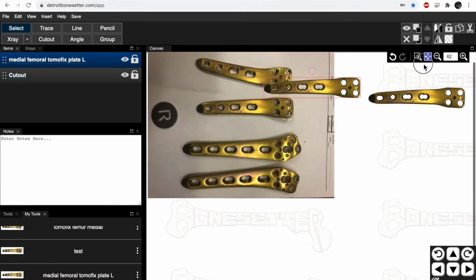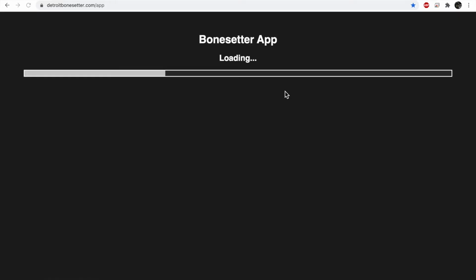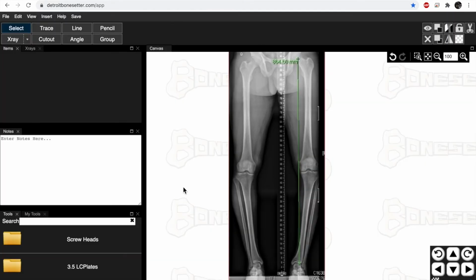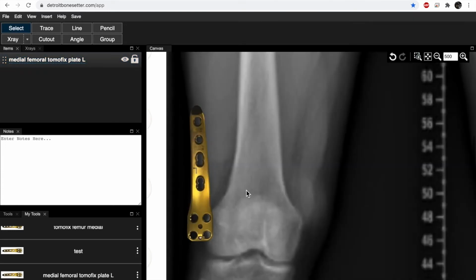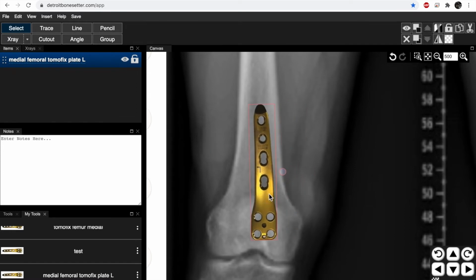And I can now put this tool on anything. Reload the site, and I come back, and let's get an X-ray. Now I'm going to go to my tools, go to the end, and I'm going to pick my Tomofix implant, and you can see now it's sized perfectly. Now this is an AP, you'd have to do a lateral, but when I blow it up, you can see there's my Tomofix implant, and it's the size that it should be.